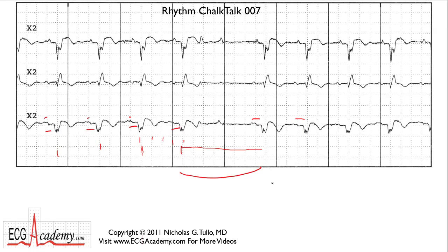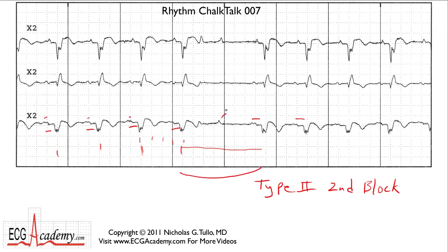So people would be tempted to think that this is type 2 second degree AV block — Mobitz 2 block — because you have a fixed PR interval, you have a P wave that fails to conduct, and the R-to-R is exactly the same as two times the previous R-to-R. So it all fits, right? I should have labeled this basic.